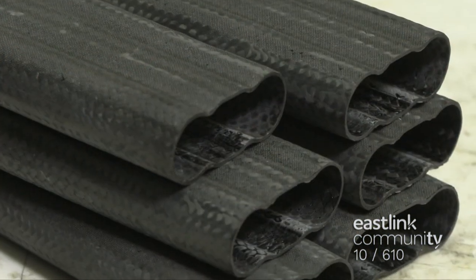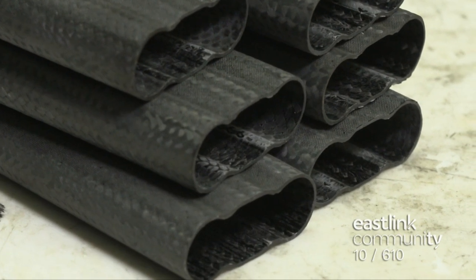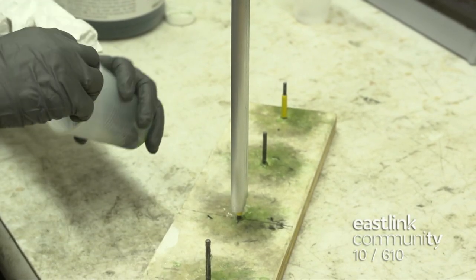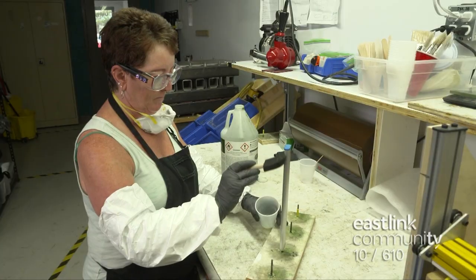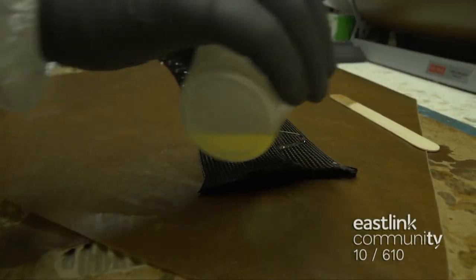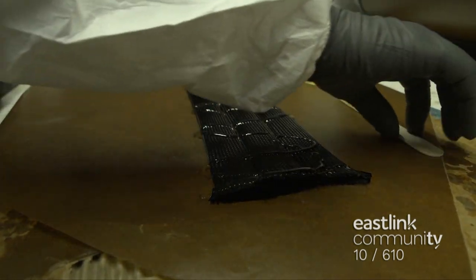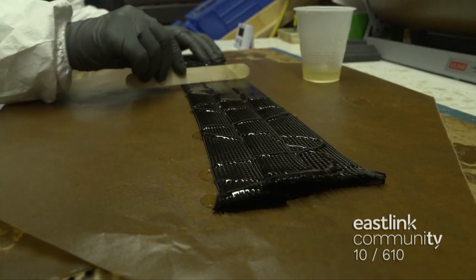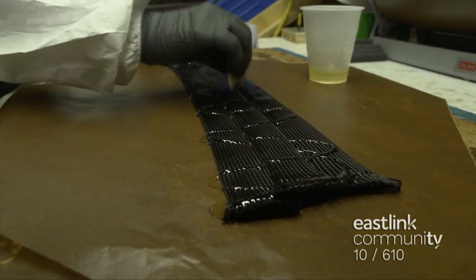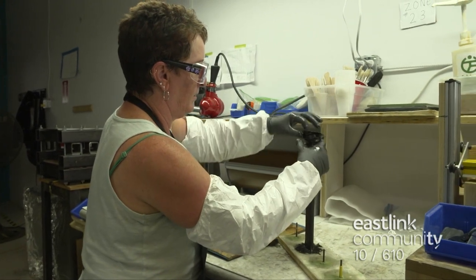Another important part of the power hinge is the carbon fiber cage that houses the spring, or the spring cage. First, a mold is prepared with a release fluid. Then glue is poured over the carbon fiber tubing and spread evenly. Each tube is gathered and placed on the mold.